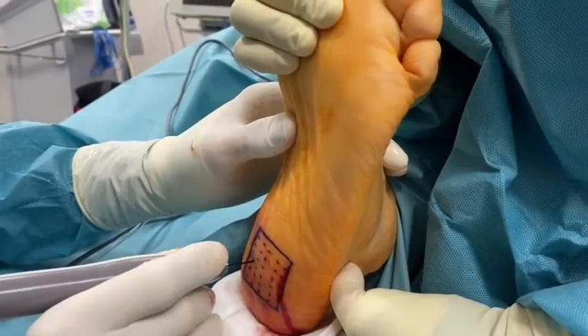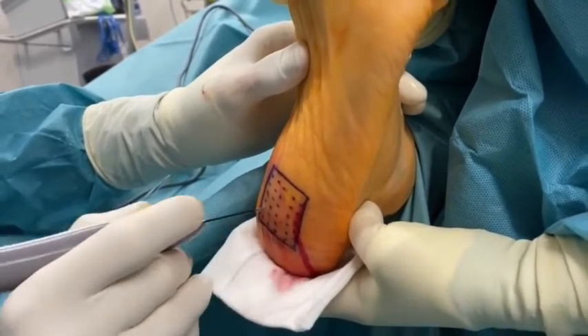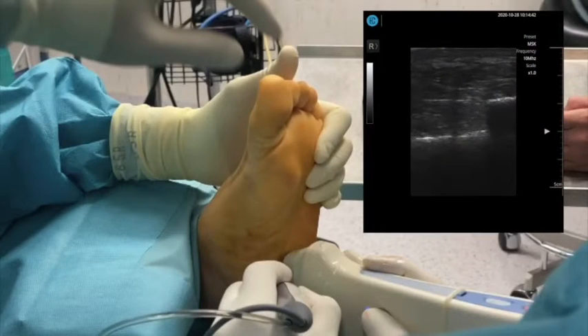Two radiofrequency impulses are delivered sequentially through each previously created percutaneous microincision. Ultrasound guidance can be used at this point too.